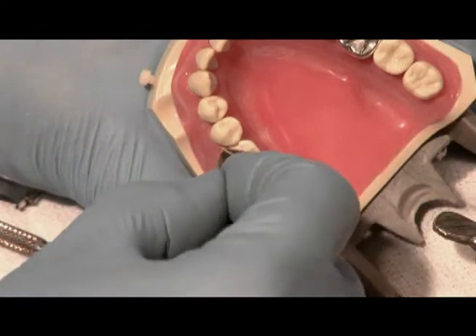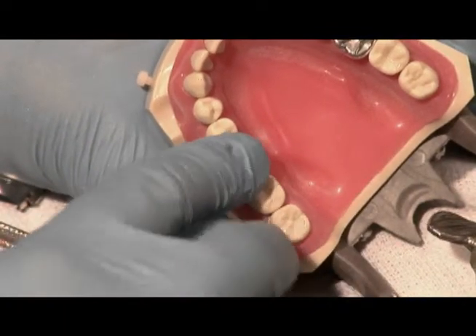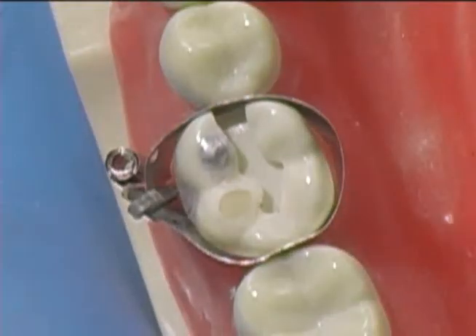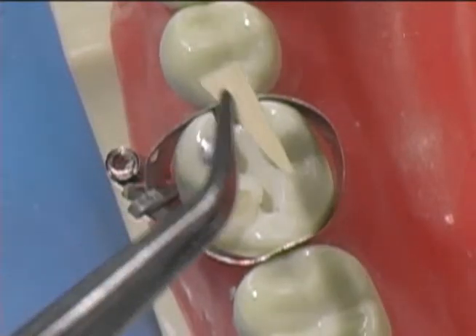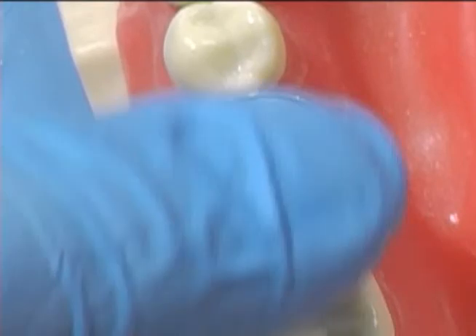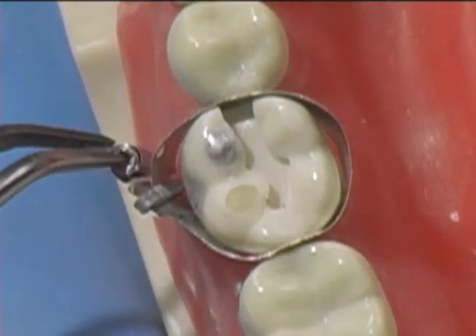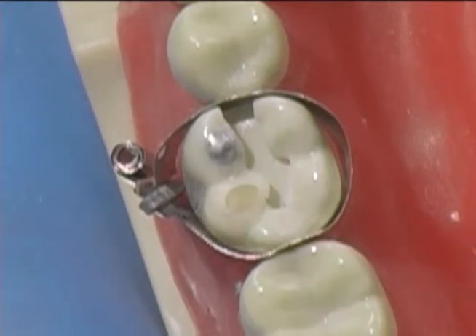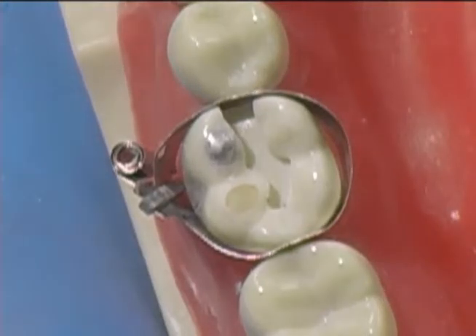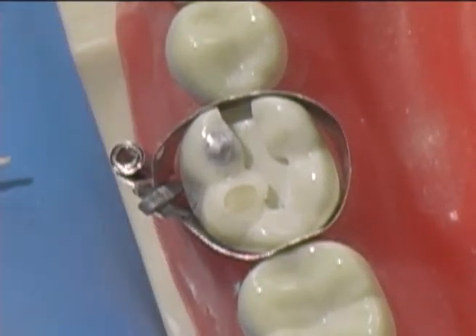We'll now place the automatrix band. Check to make sure it's not impinging on soft tissue. The band can be tightened by tightening this area here. And then place the wooden wedge from the buccal.